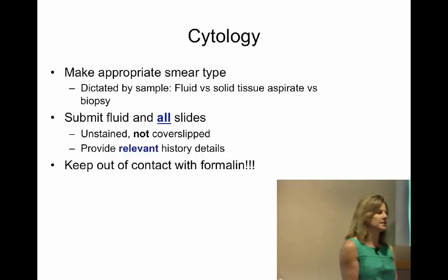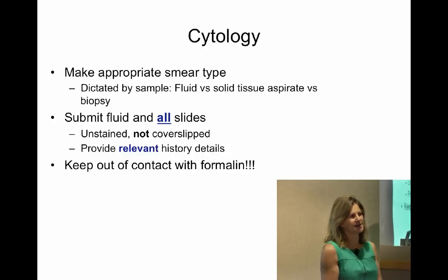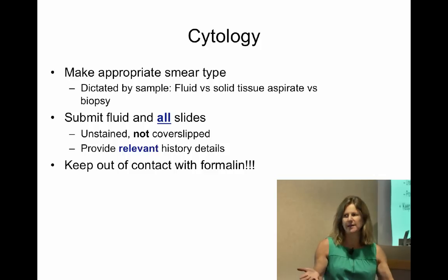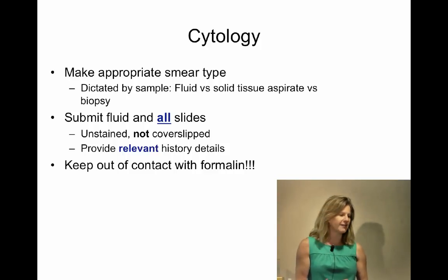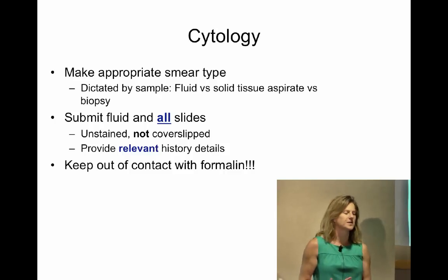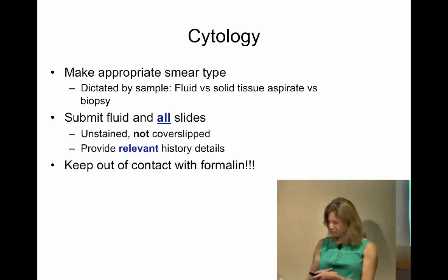Sending a slide in there, we say, I'm sorry, it's non-diagnostic, and then you call us up and say, but we saw cells, and then we're like, well, send that slide in, and then there's a week delay. So send us what you have, and if you want it back, just let us know, and if we can, we'll give it back to you, but obviously we have to keep it for legal reasons.